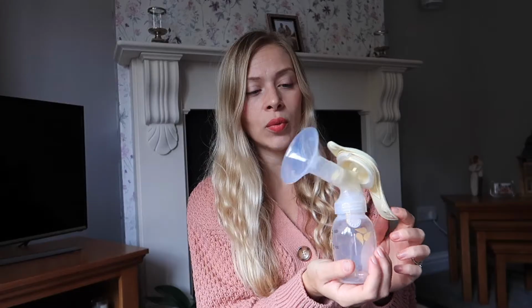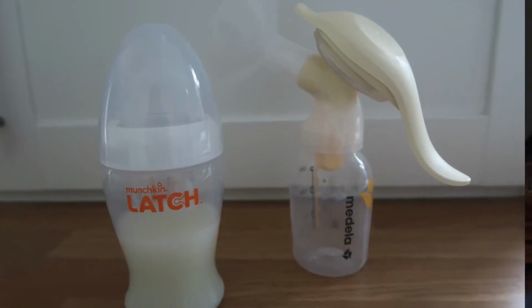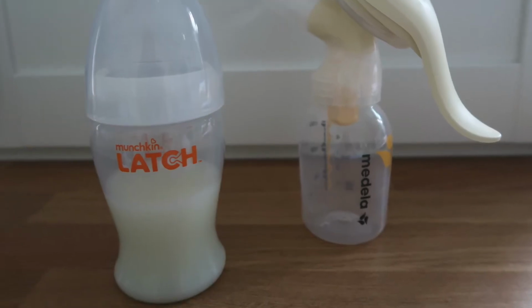If my son, now he's a little bit older, obviously I couldn't do this when he was young, if he's in his play gym on the floor, I can just sit with him on the floor, look over him. It's not quite so restrictive as being all tied up to the electric breast pump. And you're free to move around the house as well, so much less restrictive using a manual breast pump. And to be honest with you, I find that this drains the breast just as well, if not better, than the electric breast pump.